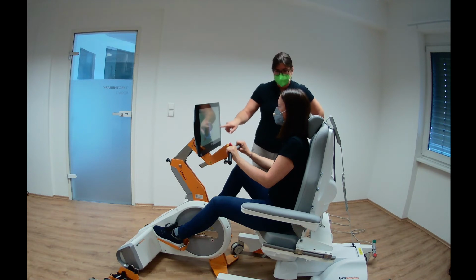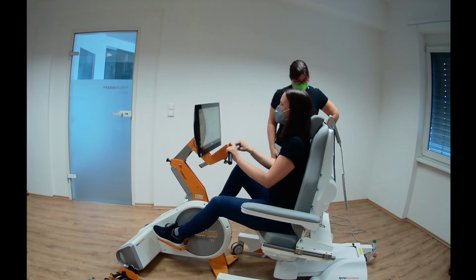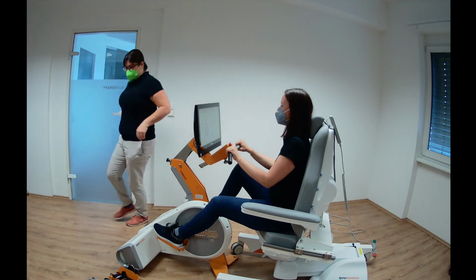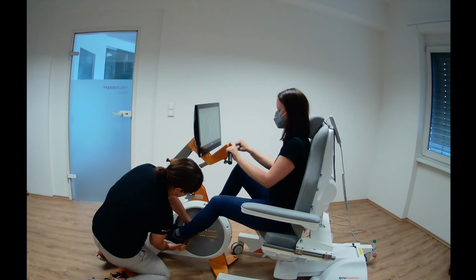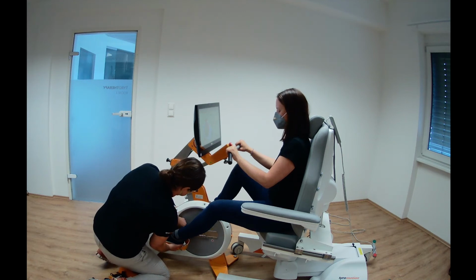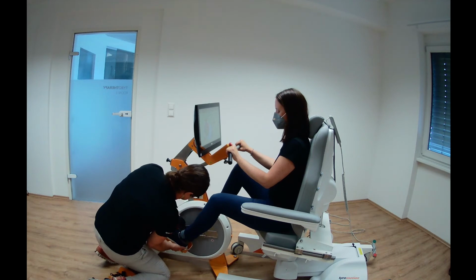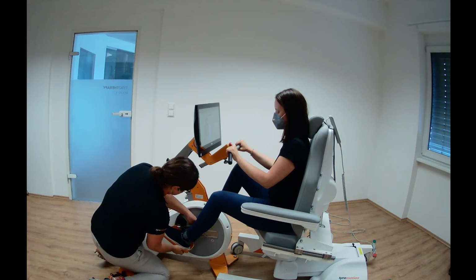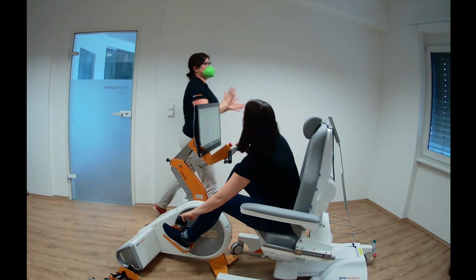I forgot which mode we have. Can you remember? It was a game. It was a game, yeah. I think it was a game. We decided it before we started the setting. So first of all, I will adjust your position again. Sorry, so that it's the same. All right, it's a game, it's the highway game in the stepper mode. Yes, I can remember again.